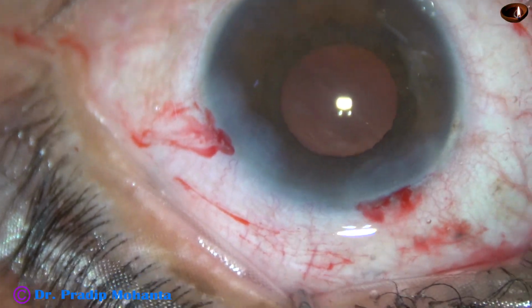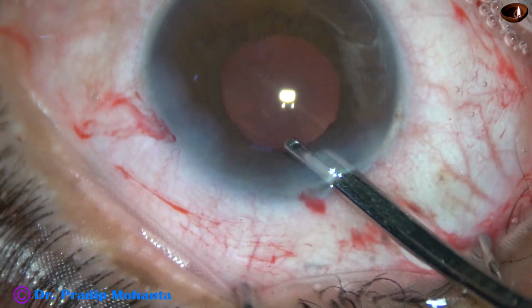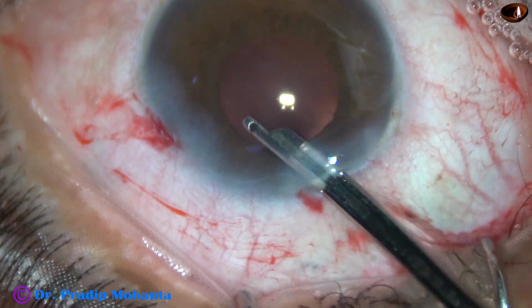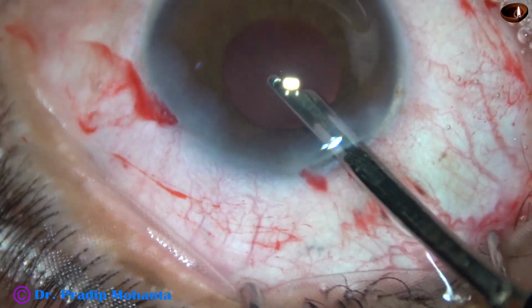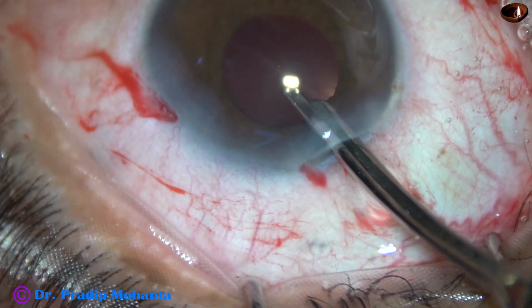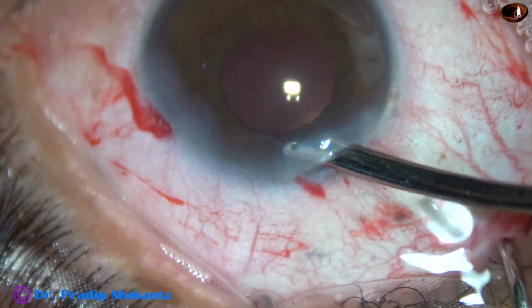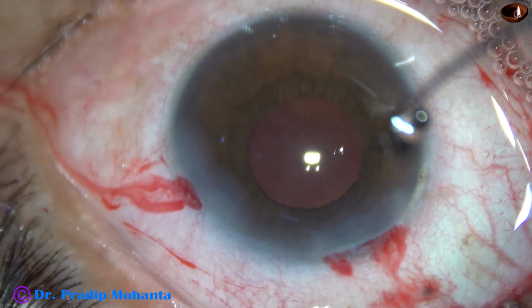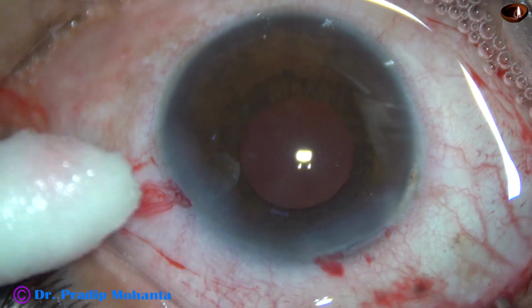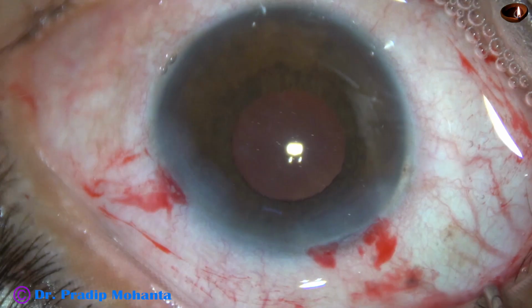So in this case the pre-chopper has helped a lot. This pre-chopper has been designed by Dr. Suhail Irfan Muhammad Khan from Nanded, Maharashtra, India. Very proud of him. This is formation of the anterior chamber. Then the integrity of the wounds is checked. A few drops of moxifloxacin are applied over the cornea and the case is concluded.